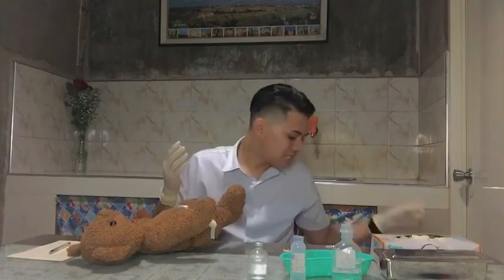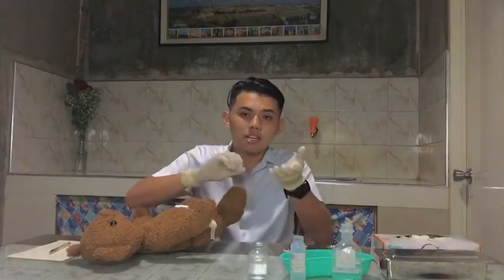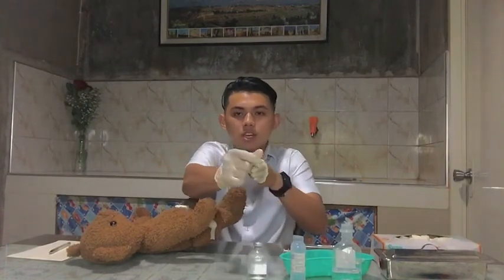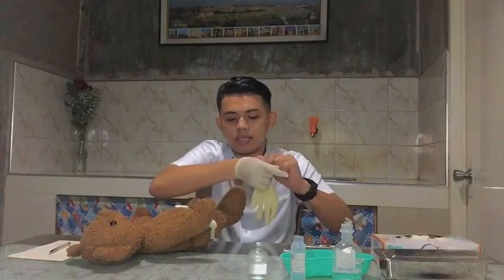So again, if bleeding occurs, apply pressure with a dry sterile gauze until it stops. Then activate the needle safety device or discard the uncapped needle and attach the syringe into the proper receptacle. This is for us again to prevent injury and prevent the spread of infections and microorganisms. Remove and discard gloves and perform hand hygiene afterward to deter the spread of microorganisms.